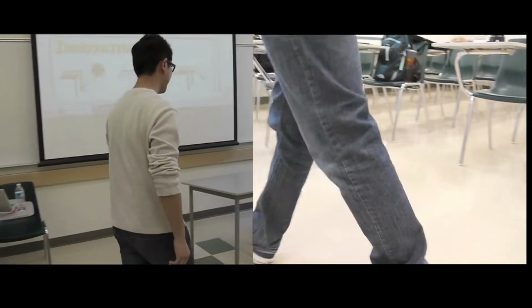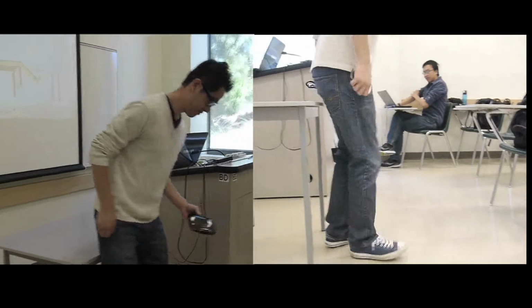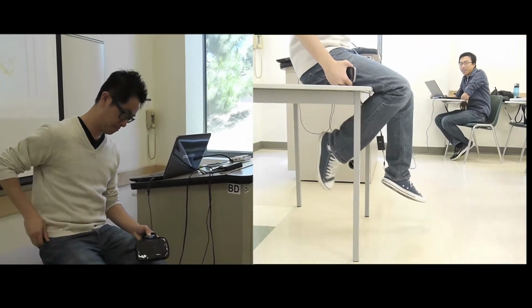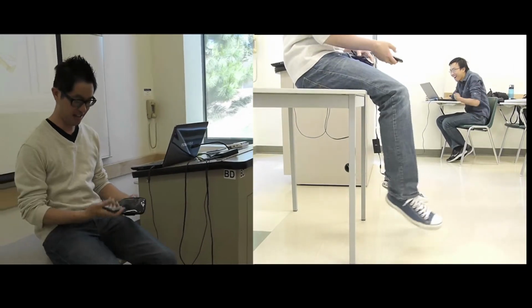First, our client must locate a place to conduct the pendulum test. The location must have a stable object high enough for the client to sit on so that he or she can swing his or her leg freely during the test. After finding a suitable setup for testing, the device is strapped onto the leg.